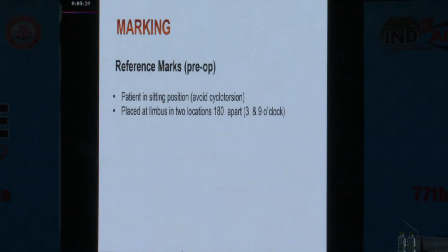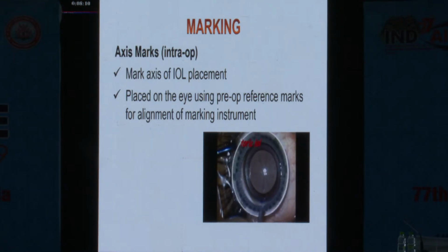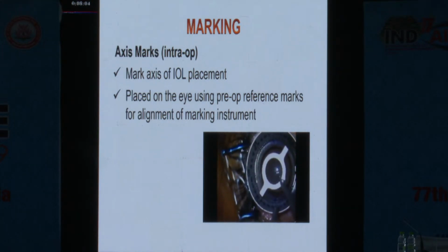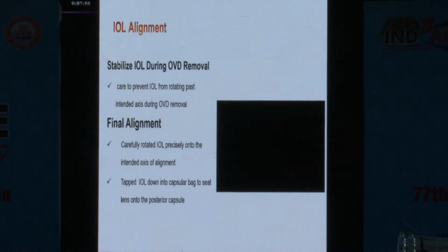0 to 180 degree was marked in the sitting position. So the marking on table was done based on the 0 to 180 degree marking, and routine phacoemulsification was done.